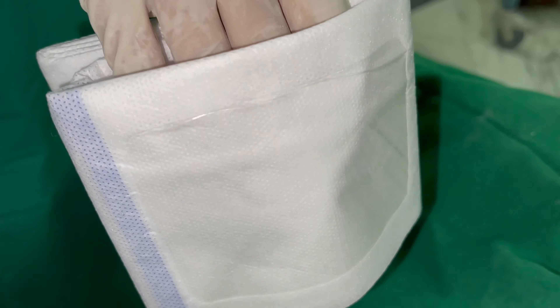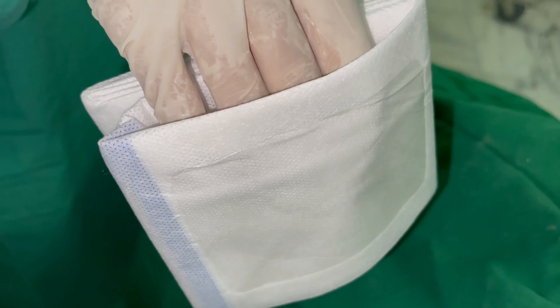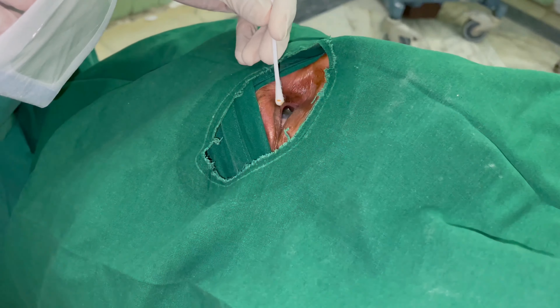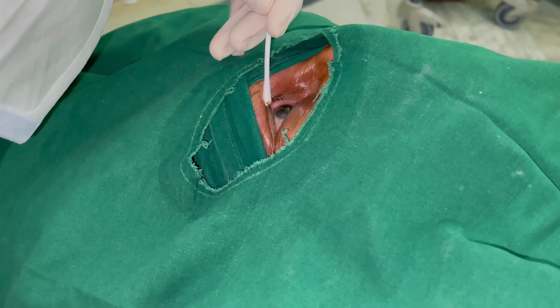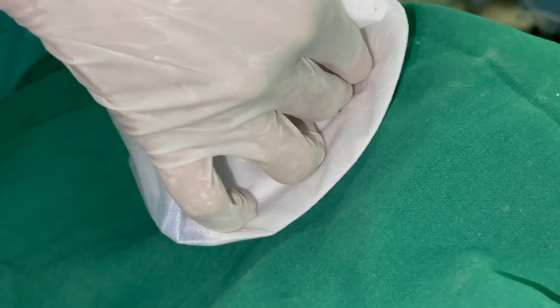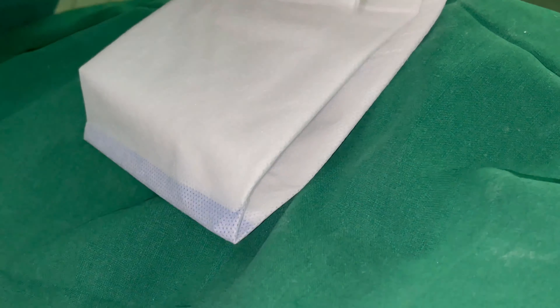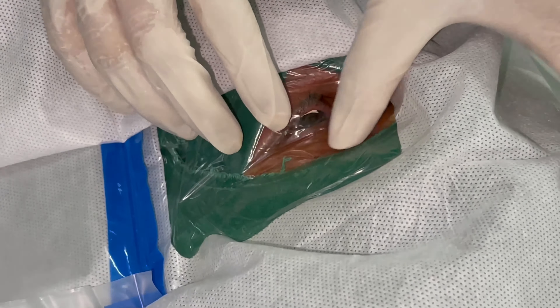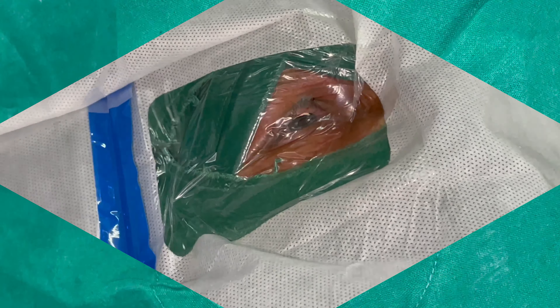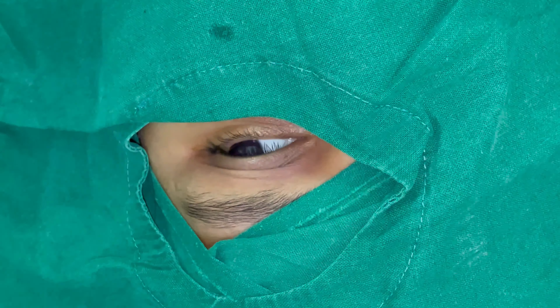A quick recap: the fingers slide in through just a thin layer of the drape, and with a cotton bud the lashes are moved away, the upper lid is pulled up, and the drape is stuck in place — making sure that the inner aspect touches against the base of the nose. In this manner, you will be able to consistently achieve optimal draping of the lids.